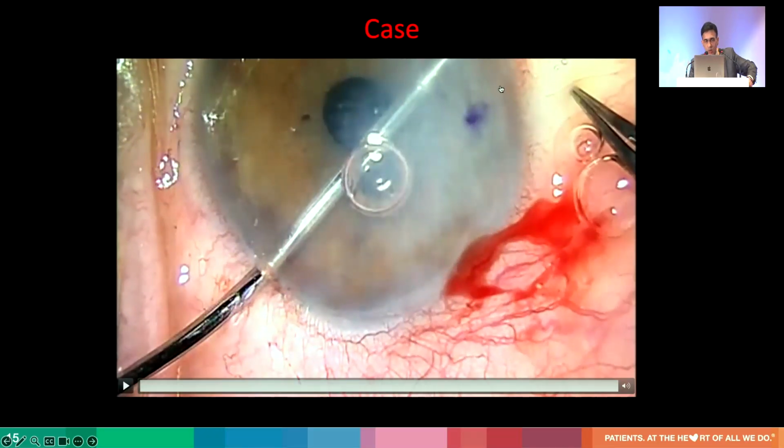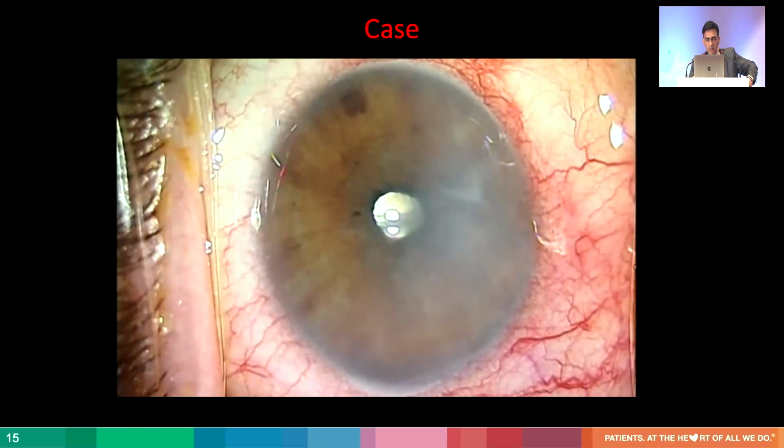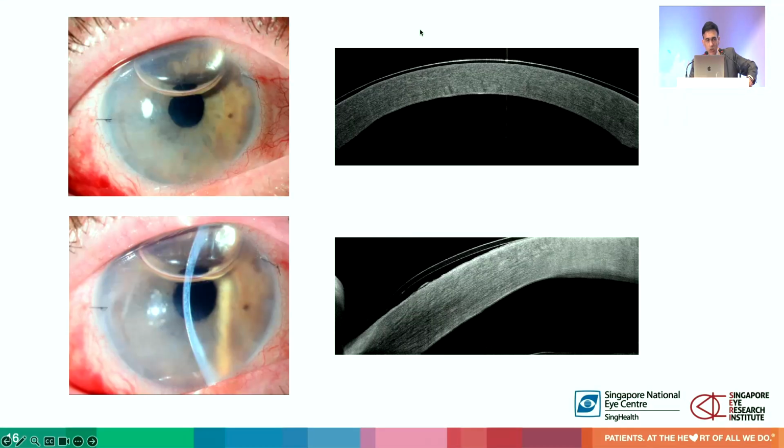What you can see is that once the stroma turns into this uniform whitish color, you remove most of the scarring. So this is what they look like. This is post-op. You can see on this side over here. So the DMEK is start. This is early post-op.